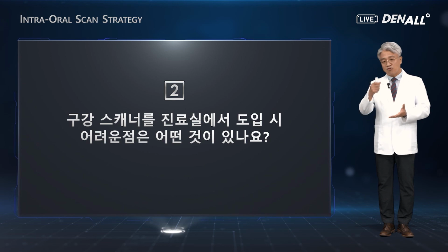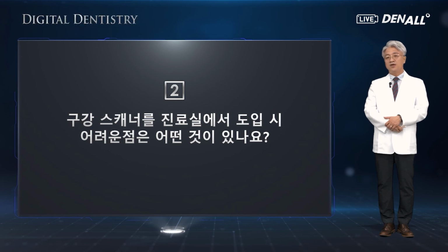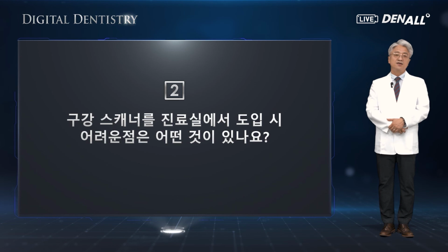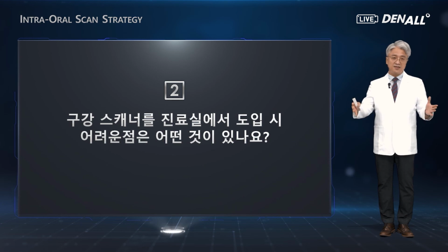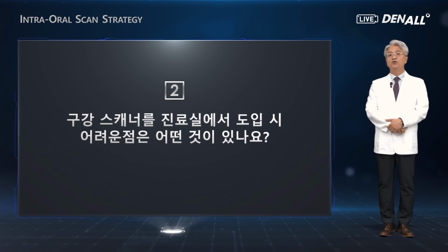Conventionally, precise impression taking was possible through training. Now, a new impression technique is adopted using the oral scanner. Therefore, the staff would resist the adoption of new technology. So it may take some learning curve before they get used to it, and that may be the biggest barrier.